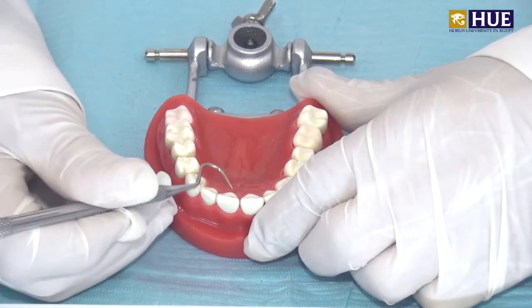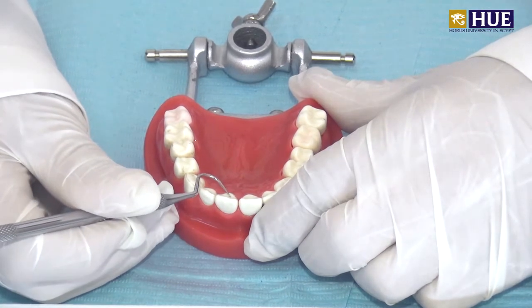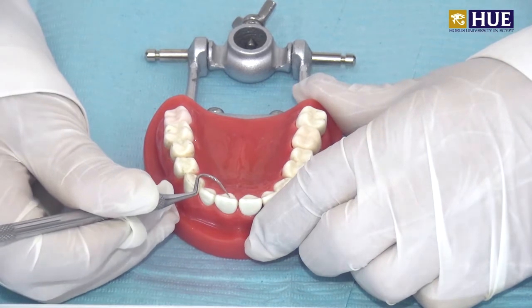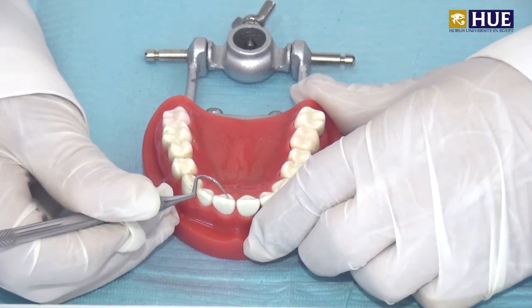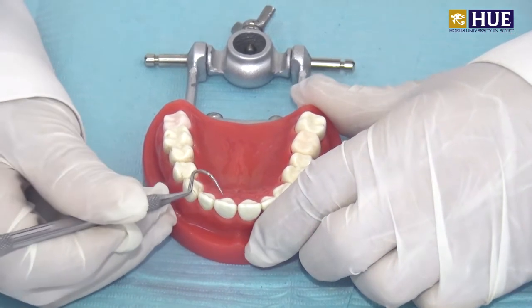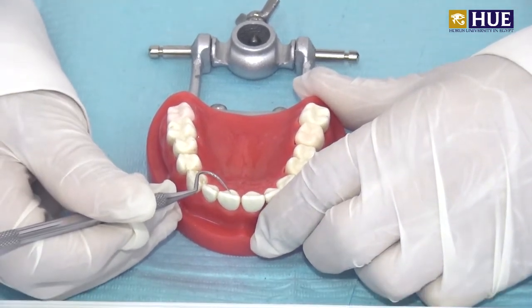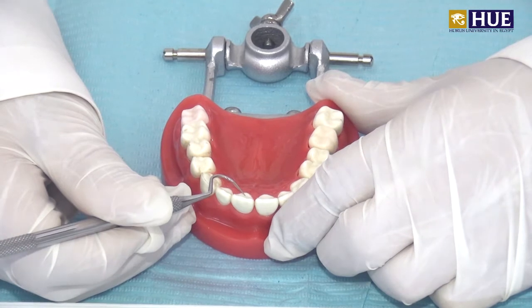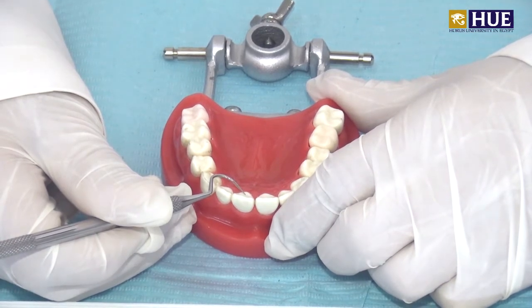The GV Black cavity has three types of designs. Number one is a design in which all margins are enamel and confined within the coronal portion. The second one is a combined design, which includes enamel margins on the coronal portion and part of the margin within the root.